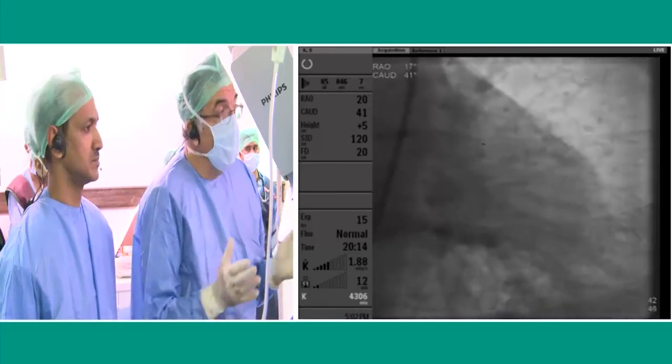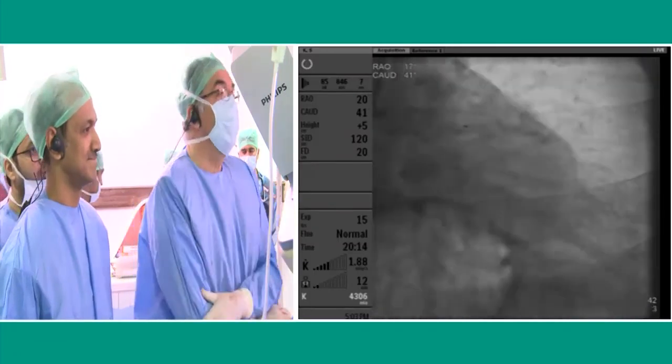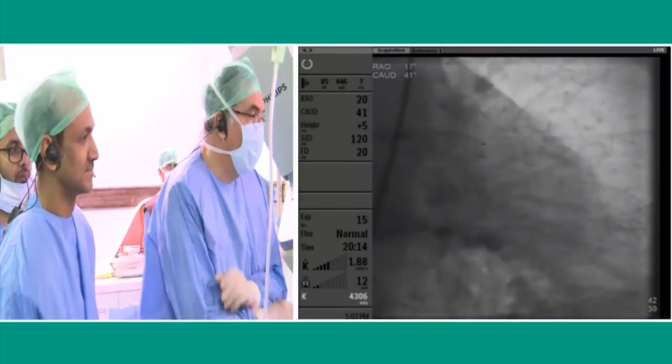Okay, that's very simple, without imaging, very beautiful. Very possible too. World-class experience on your left main stenting.